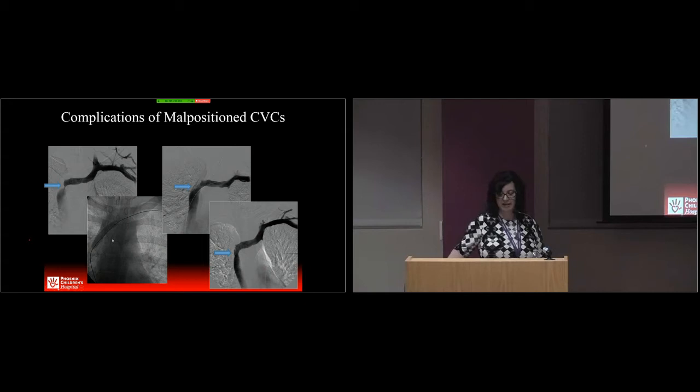We did angioplasty. Here's the left upper extremity venogram prior to angioplasty, and you see a really thin jet of contrast to the stenosis. After balloon angioplasty, the stenosis is definitely more open, and there is free egress of contrast through that stenosis into the SVC. And you can see some contrast in the wall of the vein as well.